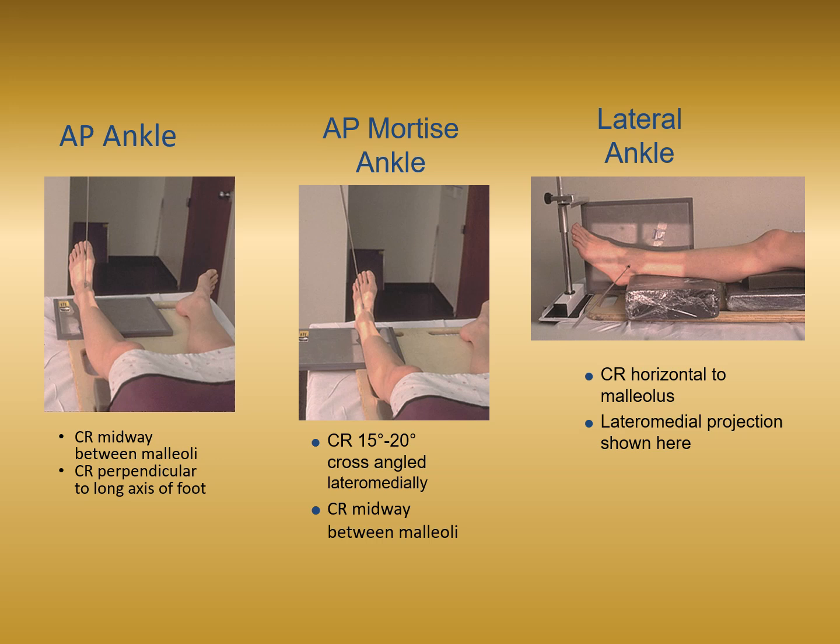Lateral ankle, cross table ankle. Once again, they've put the leg up on a sponge here to ensure that the IR is lower than the body part of interest, so that we don't clip that anatomy that we're looking for on our image. So it's always very important with those cross table horizontal beams that the IR is placed lower than the body part, and that we're centering the body part on the IR itself, so that we don't clip any of it.